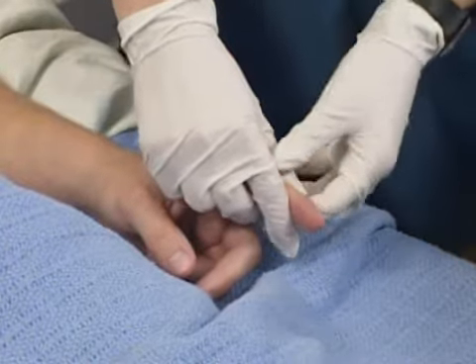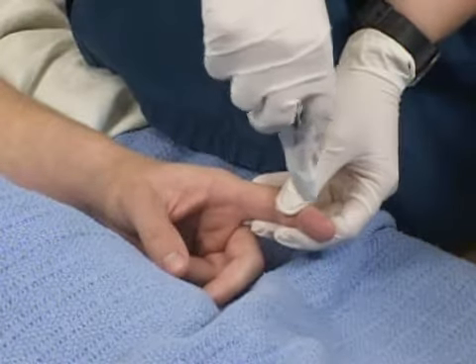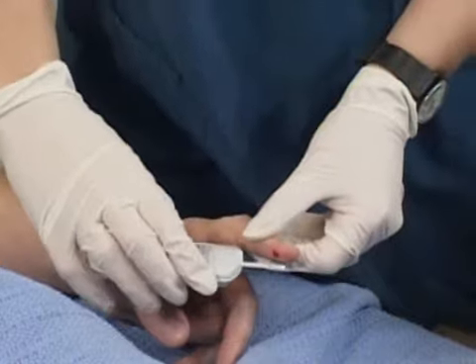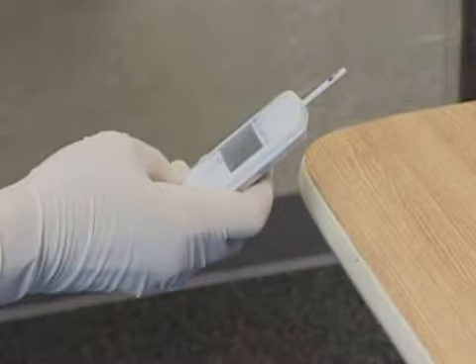While using her non-dominant hand to apply gentle pressure proximal to the site, the nurse uses her dominant hand to puncture the skin at a 90-degree angle with the lancet injector. If a lancet injector is not available, she would give the site a quick stab at a 90-degree angle with a lancet. She then applies the blood to the reagent strip and asks the client to keep pressure on the puncture site with a cotton ball until it no longer bleeds. The nurse then follows the manufacturer's directions for how long to expose the strip to the blood, whether or not to wipe the strip, and how to insert the strip and obtain the reading.